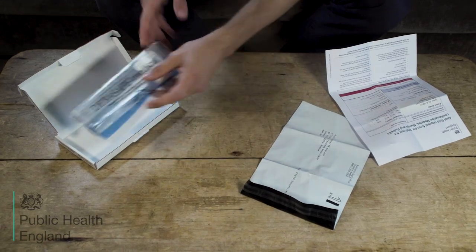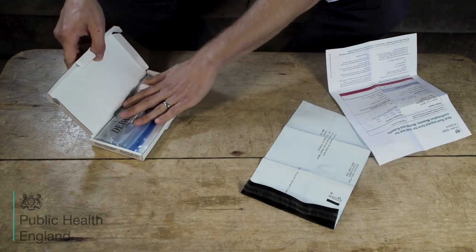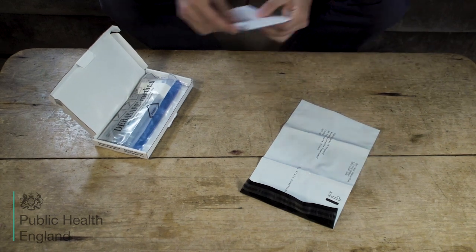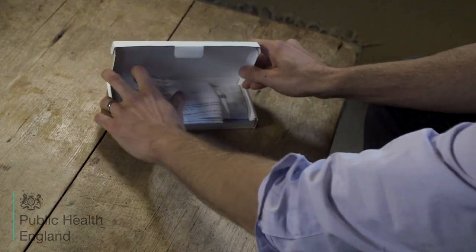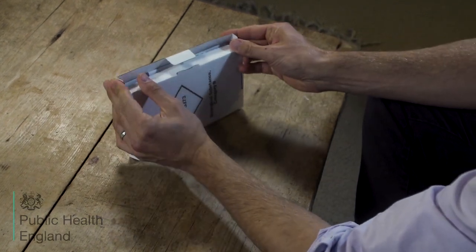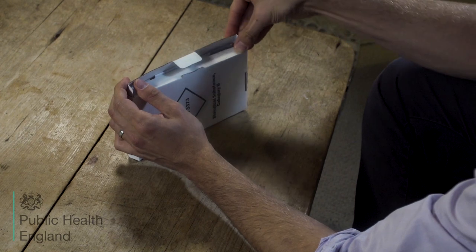When you have completed the request form, please then take the survey. Both the survey and the request form can be folded to go into the box. Place both the completed request form and the clear plastic bag containing the swab tube back into the cardboard box labelled D.